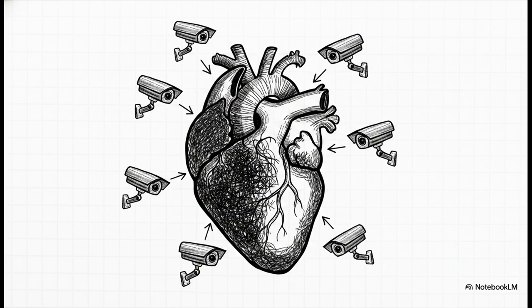Since these areas are physically right next to each other, they merge to give us our diagnosis, an acute anterolateral myocardial infarction. Our cameras are basically showing us one massive, continuous zone of oxygen starvation.